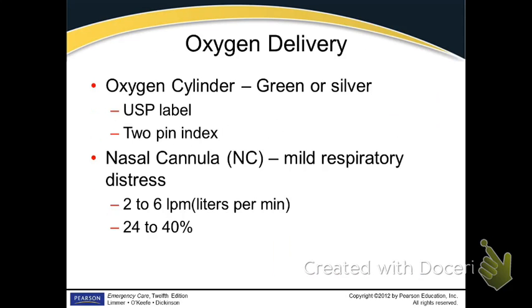Oh, yeah. So when you see this, never leave it up like this. If you see one like that, perhaps EMS comes in, they set it down, and they forget, you go over and do what's right and take that oxygen cylinder and lay it on its side like it's supposed to be. Everybody will thank you later, including the EMS. They'll look over and go, oh yeah, sorry, thanks. Because they know they made a mistake. That oxygen cylinder is supine. Okay, it gets laid flat. That way it doesn't accidentally get knocked over. Very important to remember.